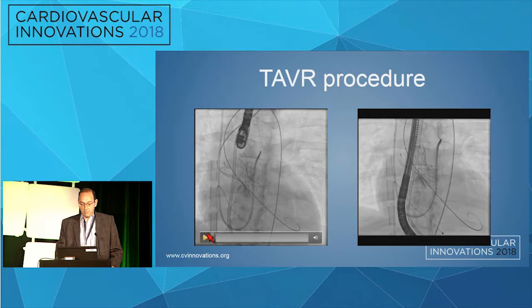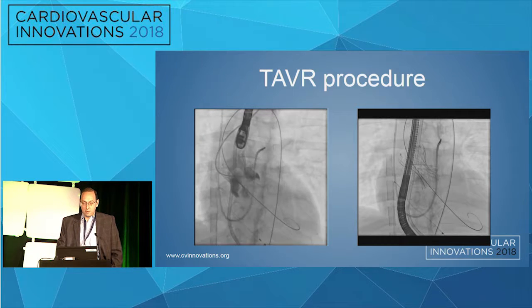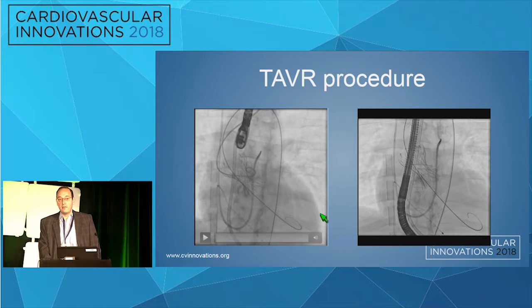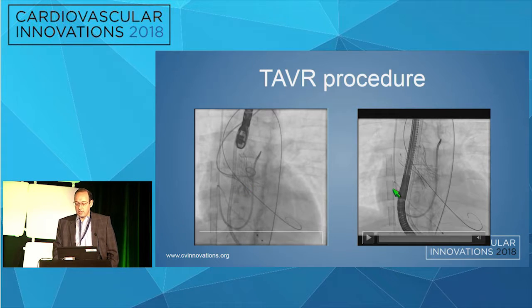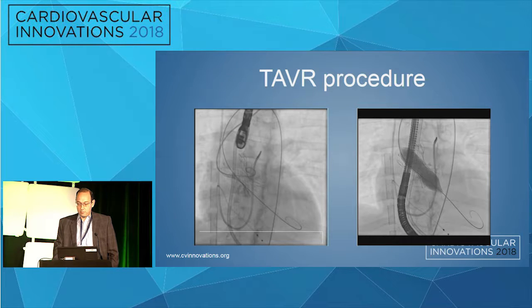Now, the only thing is the valve looked like this. And we did not pre-dilate because the hemodynamics were not great, and we were worried about the AI. There's no AI on echo, but we got a double-digit gradient. So we decided to balloon the valve. We got a 26 millimeter Z-Med balloon, and we post-dilated the valve.